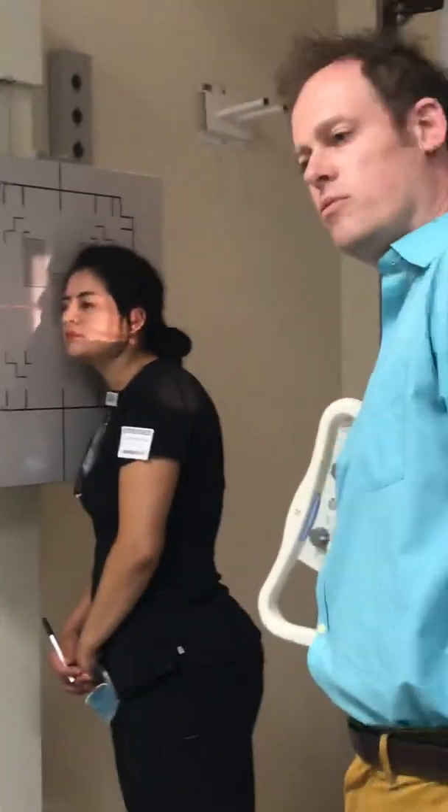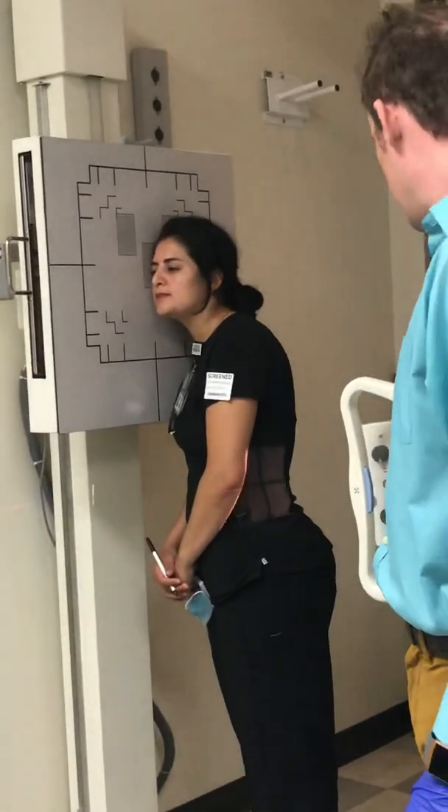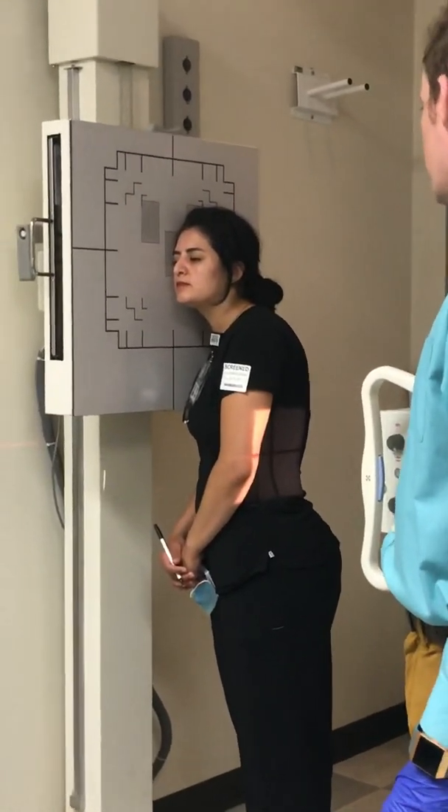It shows the IPL nice and straight. I'm going to take my angle off of my tube for this exercise. This is a perpendicular beam — no angle required at all.